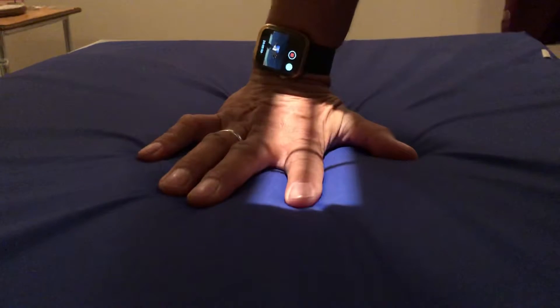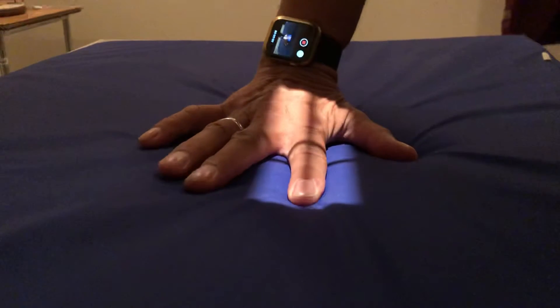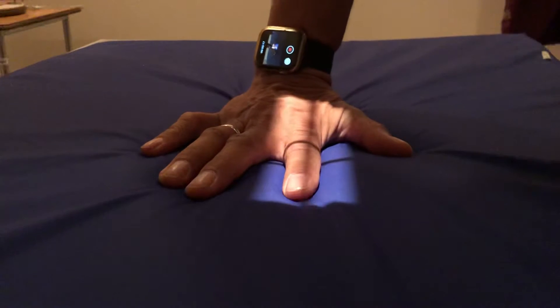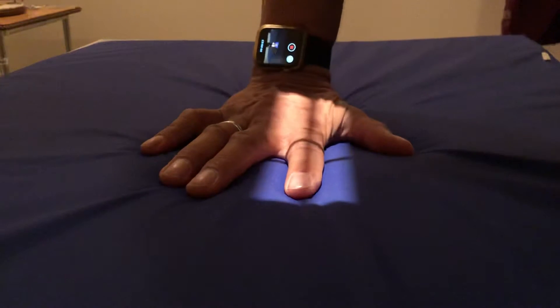Hi, you clicked on this link because you want to know how to take an x-ray of the index finger, and I'm going to show you how to do it perfectly every time. This is a finger exam of the index finger and what we're going to do is take four pictures, because it's a multi-joint. The four pictures are going to be a PA, both obliques, and a lateral.